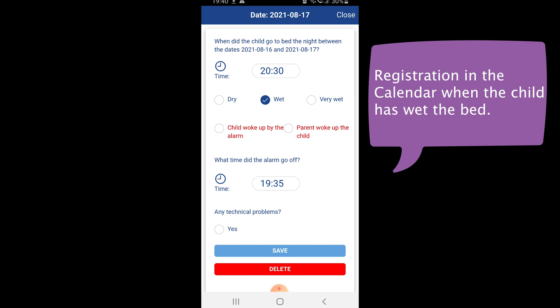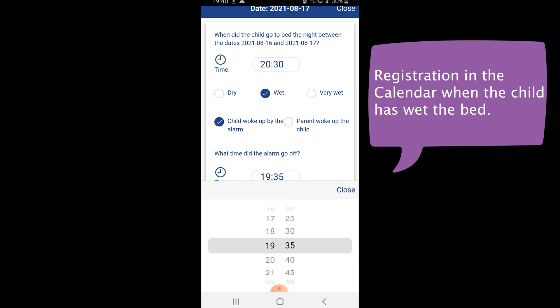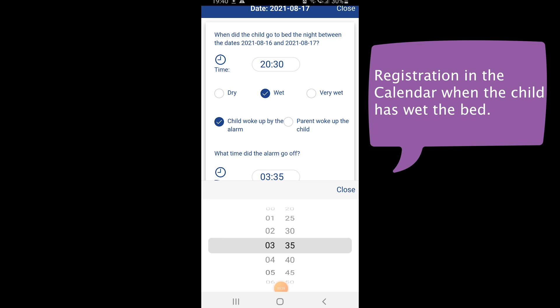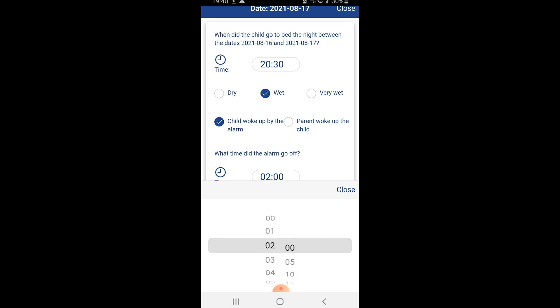It is common that the parent has to wake up the child in the beginning of the treatment, due to the fact that many children with bedwetting problems are deep sleepers. In this example, we enter that the child woke up by itself, and next the time of the alarm was at 2am in the morning. Save and you are done with the entry.